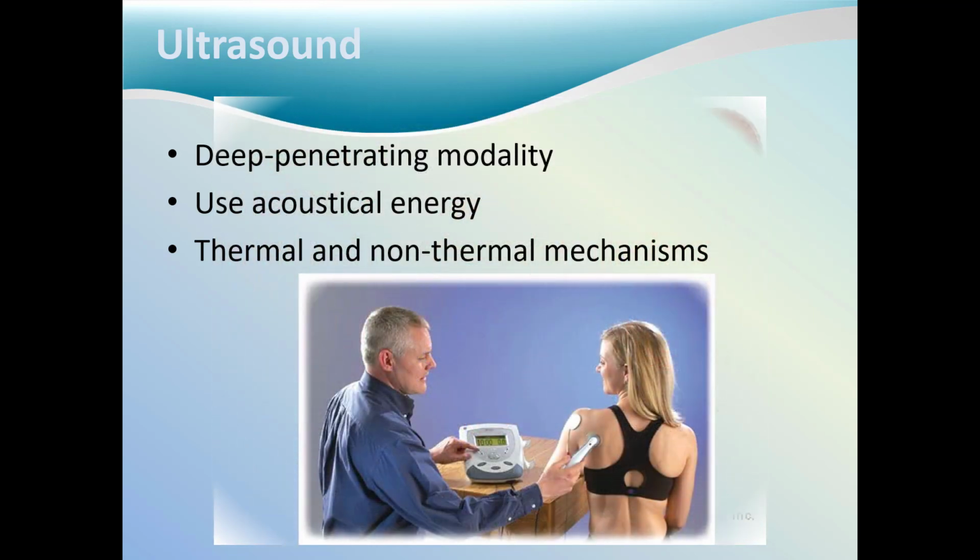Ultrasound is a valuable modality for many different injuries, but primarily is used for the purpose of stimulating the repair of soft tissue injuries and relieving pain. Ultrasound's acoustical energy has an effect on both normal and damaged tissues, but may have a greater effect on the damaged tissues.